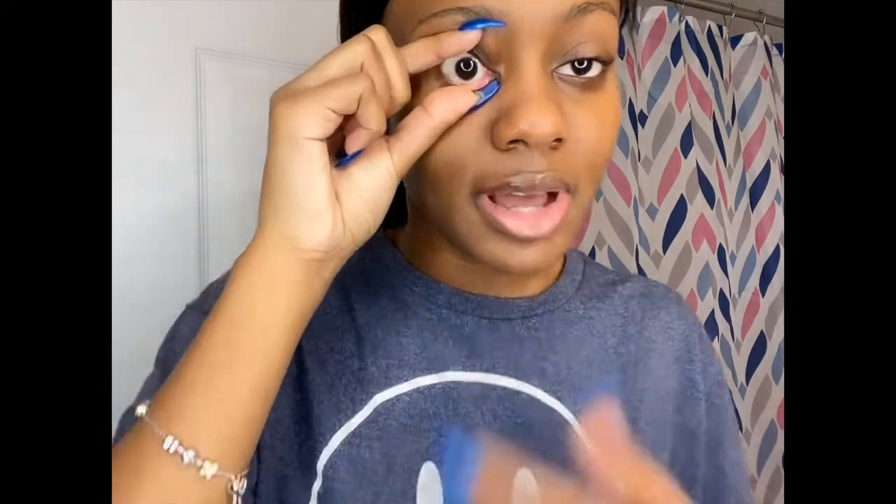I'll just squirt some solution into the case like so, then open the contact. I try to put the contact inside of there but sometimes it doesn't work — be careful because you can easily break these. The technique I use: I take my left hand, these two fingers, and push the lid up, then push the lower lid down so my eye is opened up. Then I use the pointer finger to put the contact in.